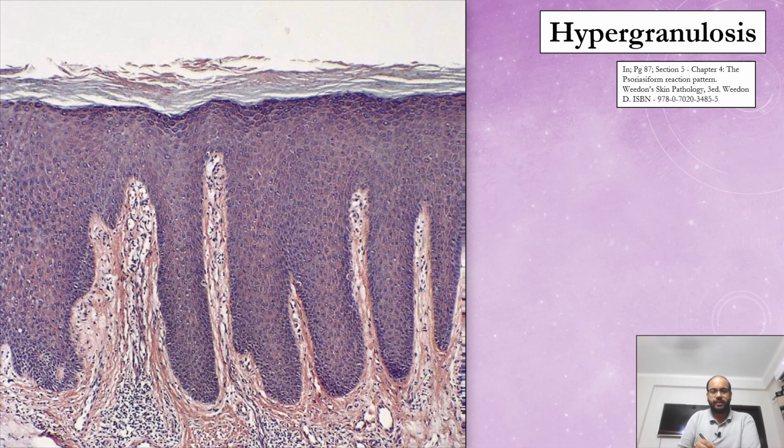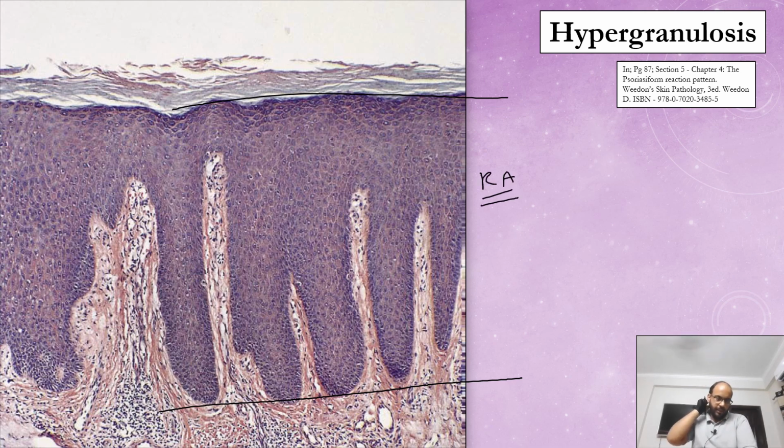For example, here, this is the involved slide, and you can actually draw a line like this. And this is regular acanthosis. Some people might ask why it is regular acanthosis when this area is thinner. This area is not thinner. It is actually normal. It is the same as this. But the epidermal downward papillae are reaching similar heights. This level is nearly the same. So it is regular acanthosis.